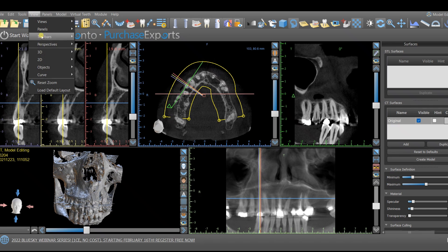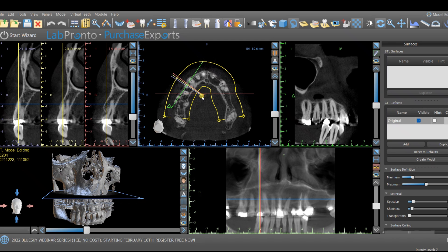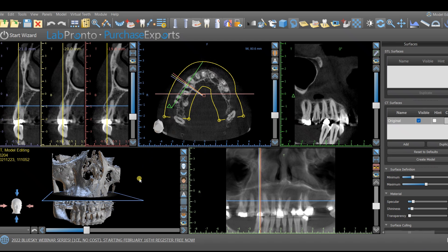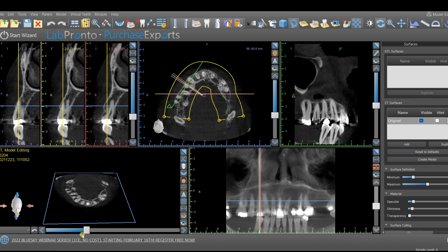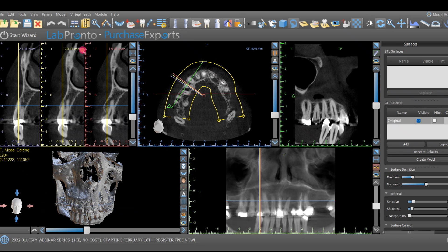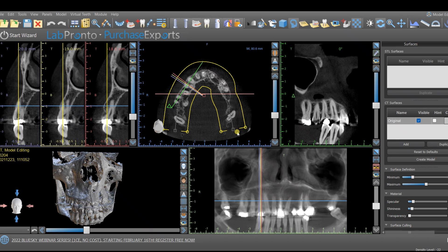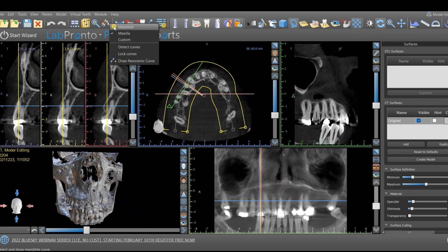As I am moving through the 3D view — here, the 3D axial projection — you can understand how this blue line is working. This curve here is the panoramic curve, placed automatically by the software. If you want to make it longer or shorter, the panoramic view will show more or less anatomy. You can also make two separate curves for the upper and lower arch — mandible and maxilla — from here.